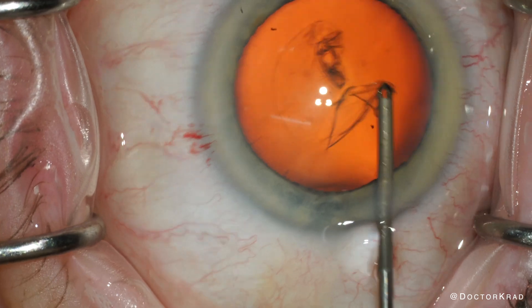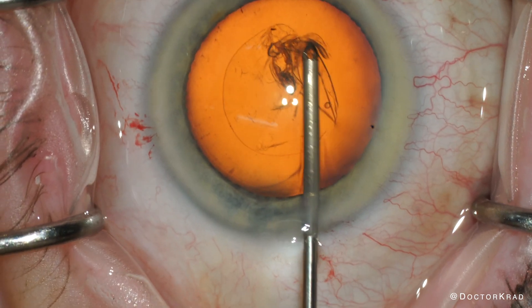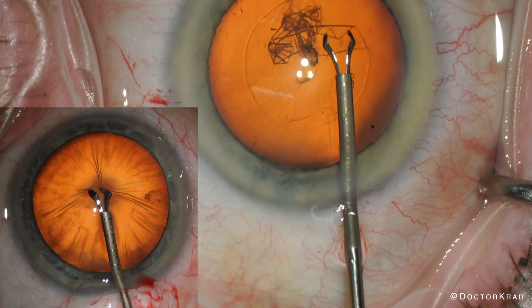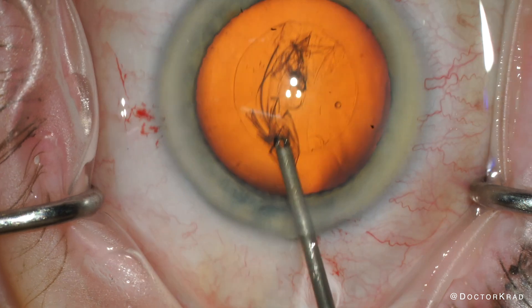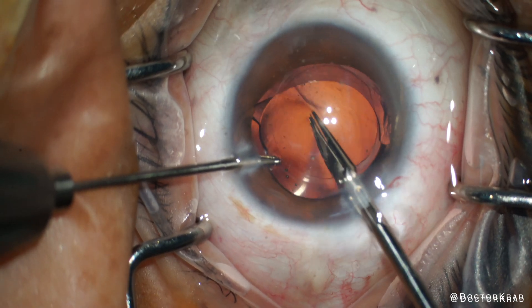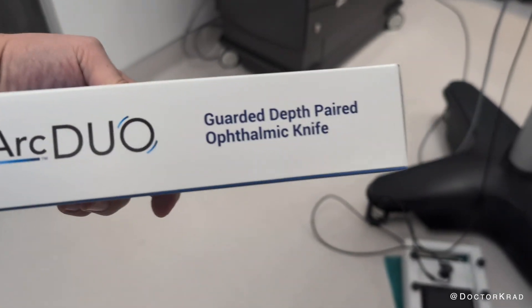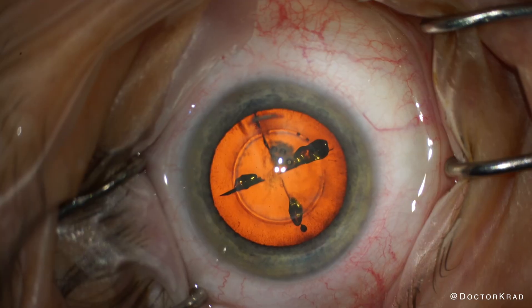MST is famous for making beautifully engineered surgical instruments for eye surgery. I currently use their capsulorhexis forceps during cataract surgery, and if I ever need to cut out a lens from the eye, I use their IOL graspers and scissors to do that. The purpose of the ARC Duo device is to create manual LRIs with laser-like curvature and accuracy.